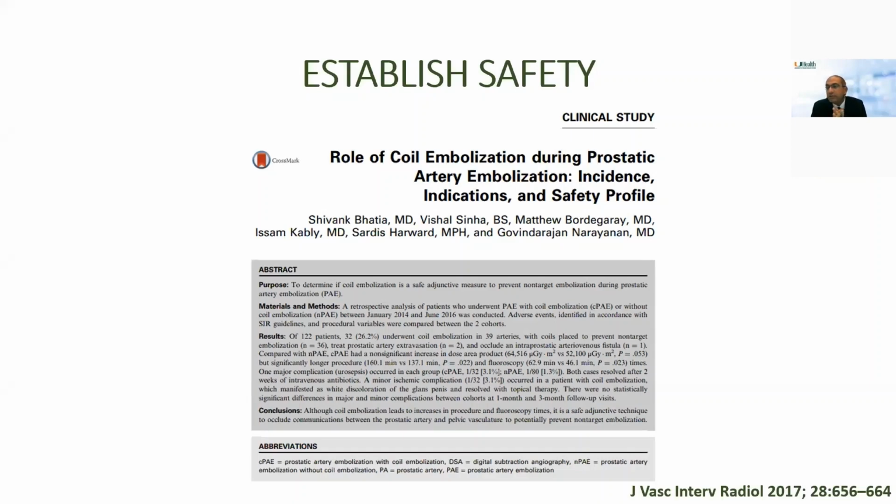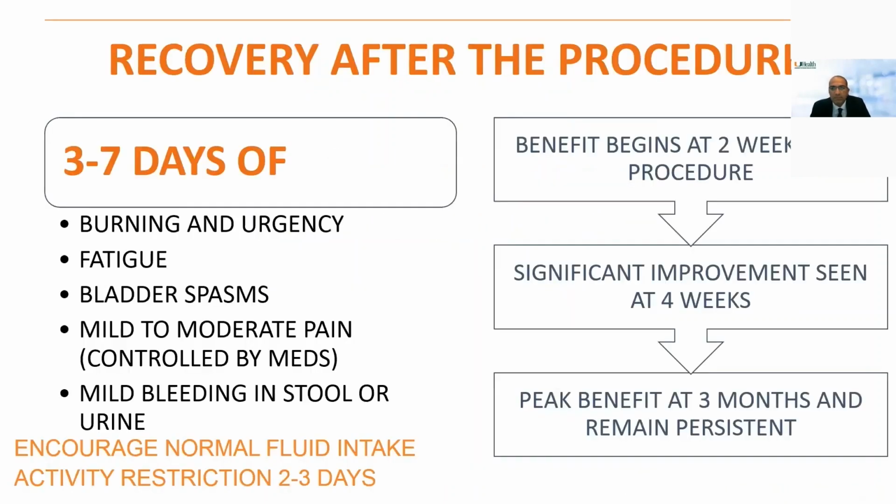So we didn't even know whether we could use coil embolization safely to block off the blood flow to these small collaterals to the rectum or bladder, or sometimes those small communications to the penis. But once we did this study from 2014 to 2016 of 122 patients, we concluded that it's safe to coil embolize these branches without any clinical consequence, including any erectile dysfunction. We did not see any erectile dysfunction either.